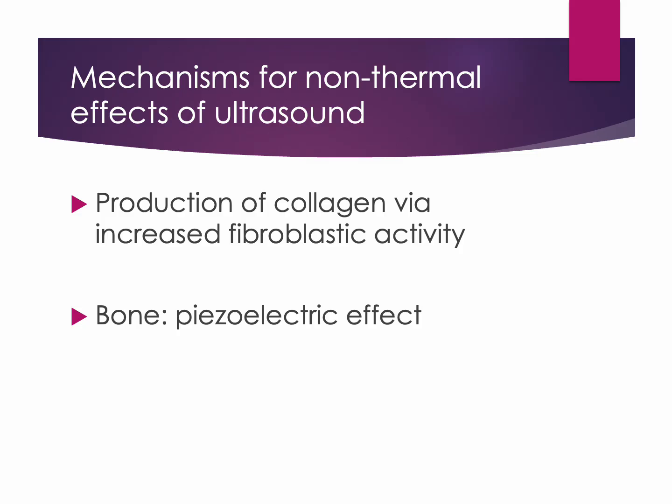Another proposed effect of non-thermal ultrasound is stimulation of fibroblastic activity, which may contribute to increased collagen production during tissue healing. Fibroblasts are one of the primary repair cells in connective tissue and are responsible for synthesizing collagen and extracellular matrix components. The mechanical effects of ultrasound, particularly acoustic streaming and stable cavitation, are thought to alter cell membrane activity and cellular signaling pathways, which may increase fibroblast metabolism and protein synthesis.